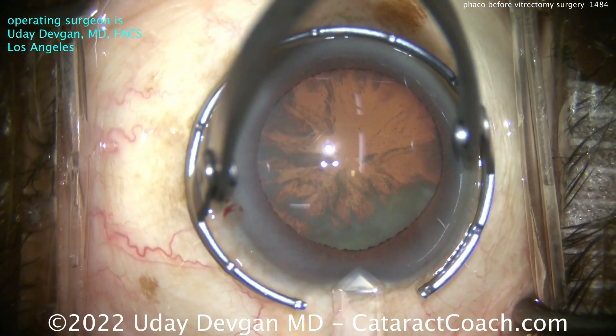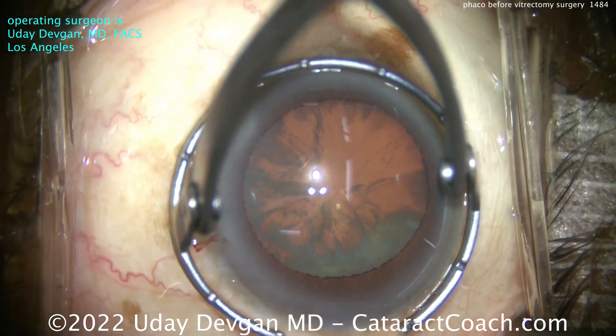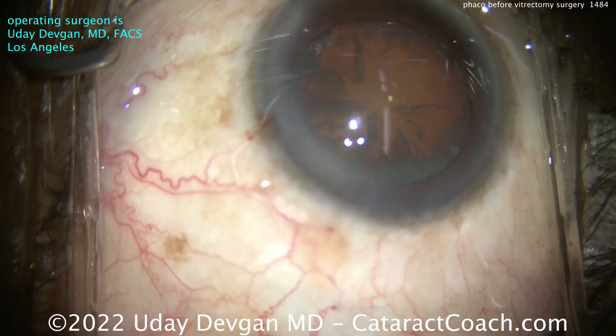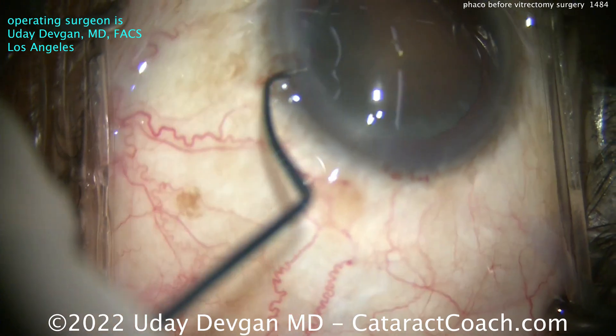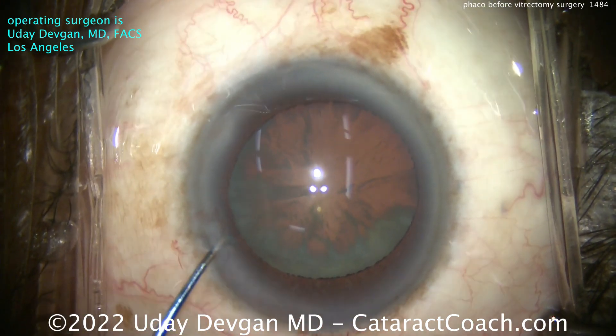Step one is this: make a sufficiently long incision. You need to have an incision that has a relatively long tunnel length. This incision has to stay closed and sealed during the vitrectomy, and especially as there's higher pressure in implanting the trocar. This patient is not doing a good job of fixating, so we'll put the chopper in to help fixate the eye.